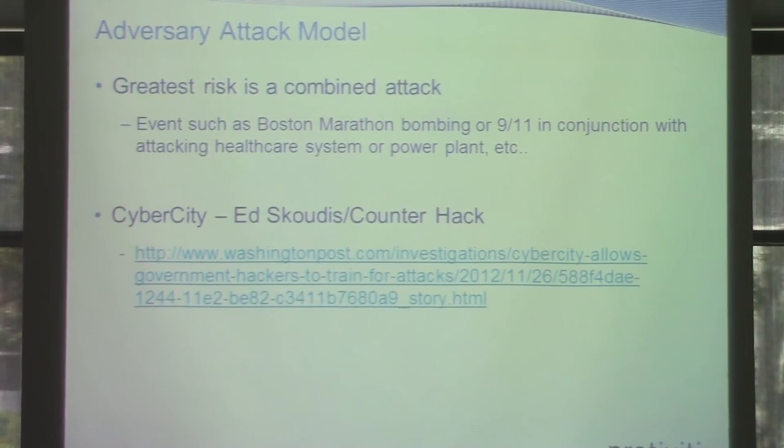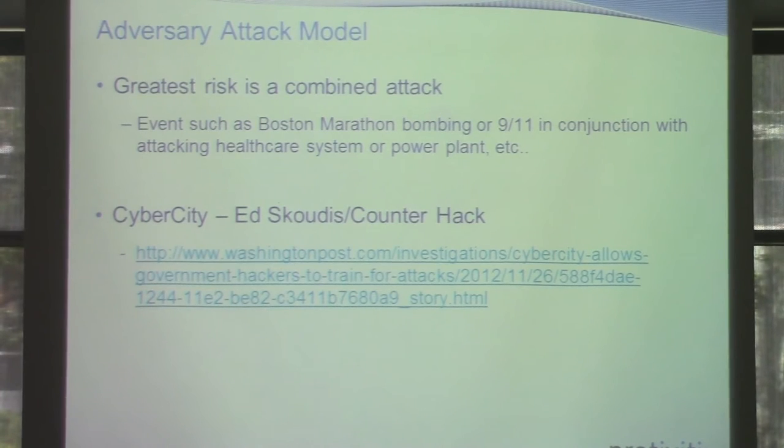So what's the greatest risk? Reality, right now, it's probably a combined attack, and not even necessarily just the medical devices. It would be something like taking down the ICS infrastructure in a hospital, or taking down the HVAC component to an OR. OR and heat control is very critical to infection prevention. If those interchanges start pulling air from outside, the OR becomes a dirty and not a sterile place, which can cause a lot of infection.